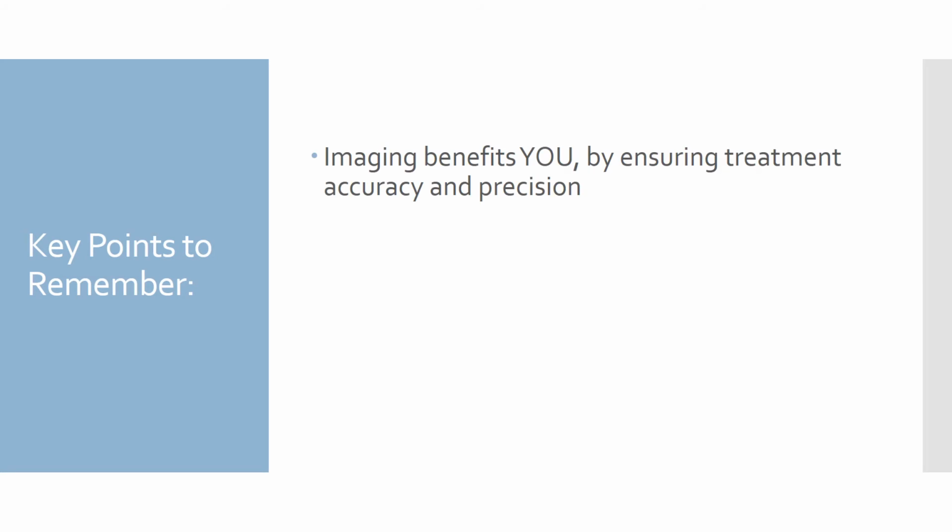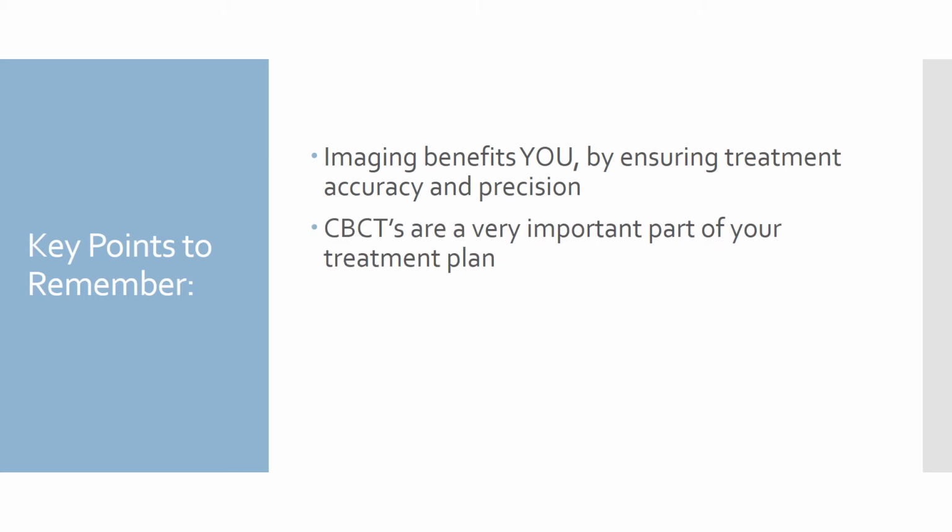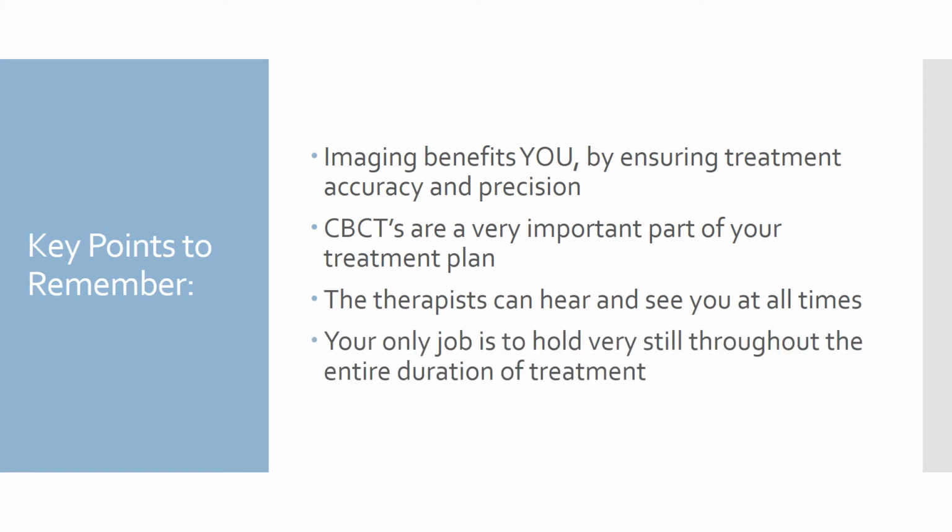Imaging benefits you by ensuring treatment accuracy and precision. CBCTs are a very important part of your treatment plan. The therapist can hear and see you at all times. And finally, your only job is to hold very still throughout the entire duration of your treatment.